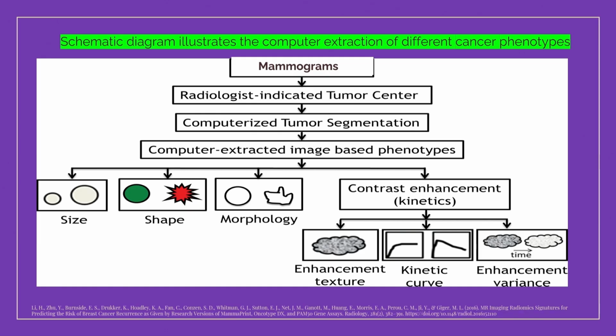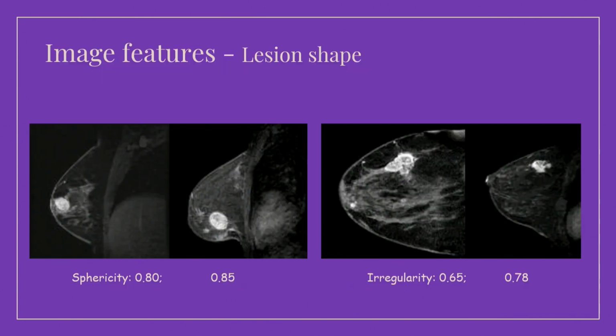Okay, you highlight the region and then take it out. And then you also have to label or tag what the meaning of this is, all right? So for example, you highlight a lesion here, and then you label it as whether it's a round shape or not, all right? So you give an index. And then the image on the right is about the irregularity, whether the boundary of the lesions is actually regular in shape or not, and then you label it with another index.